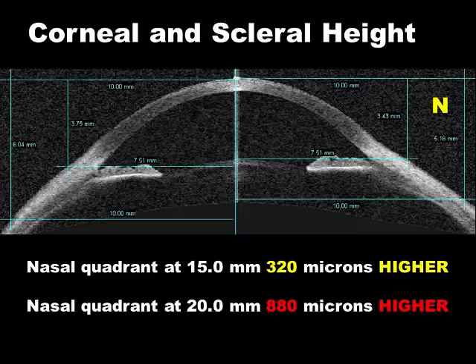They tend to be slightly temporal. Most scleras tend to be slightly with the rule, meaning the vertical meridian is steeper than the horizontal meridian. Then we have gravity and lid force pushing the lens down slightly. So that's why it's not uncommon to see this kind of superior thinning and nasal thinning, because the lens is going slightly down, slightly out.